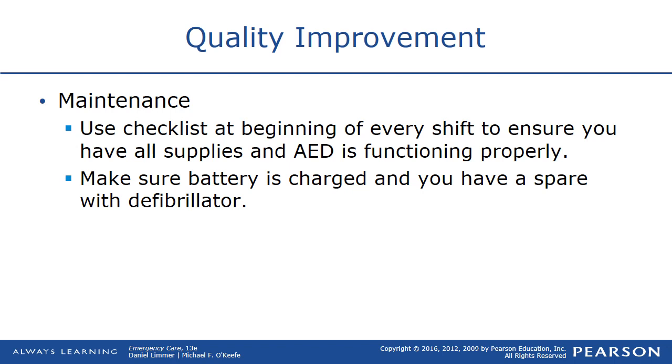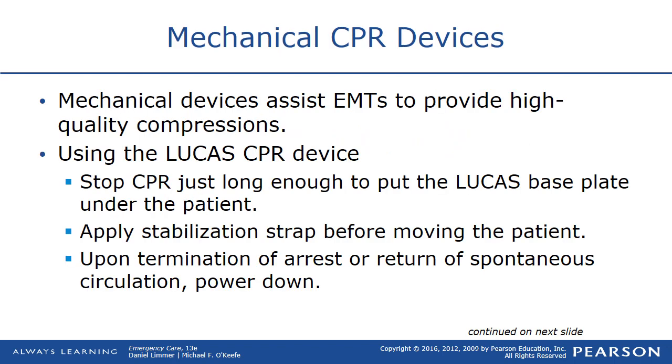Maintenance. Use a checklist at the beginning of every shift to ensure you have all supplies and the AED is functioning properly. Make sure the battery's charged and you have a spare with the defibrillator. Mechanical devices assist EMTs to provide high quality compressions.